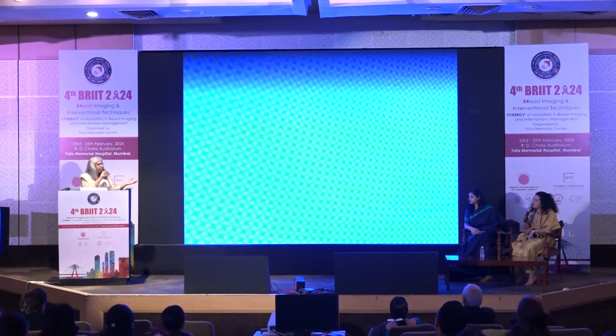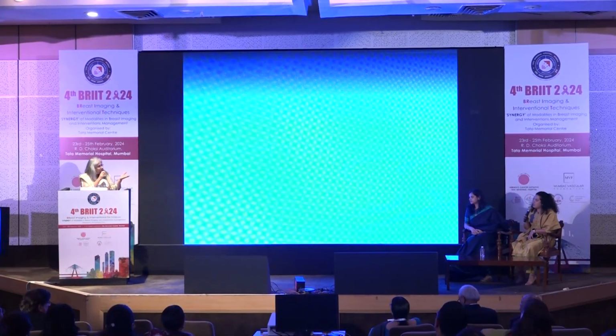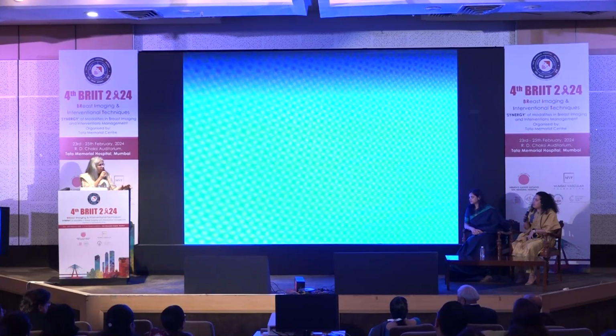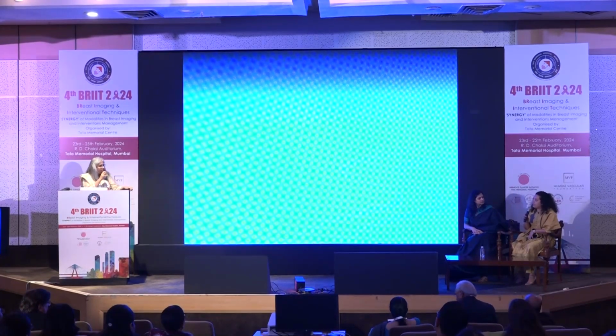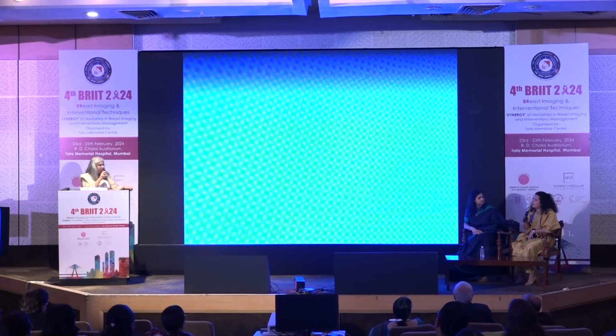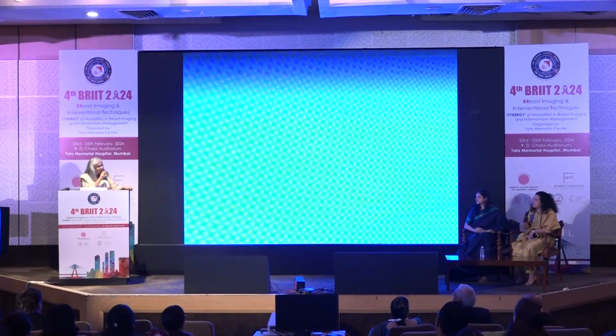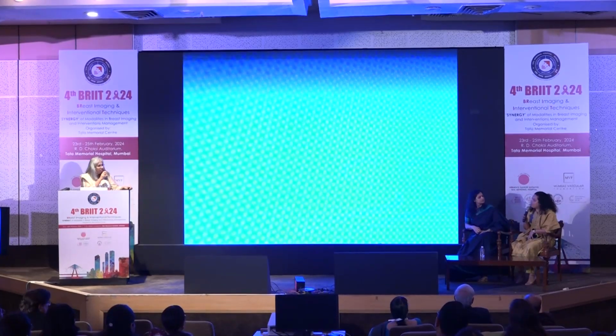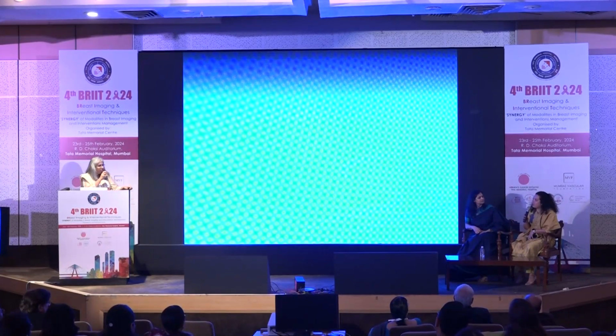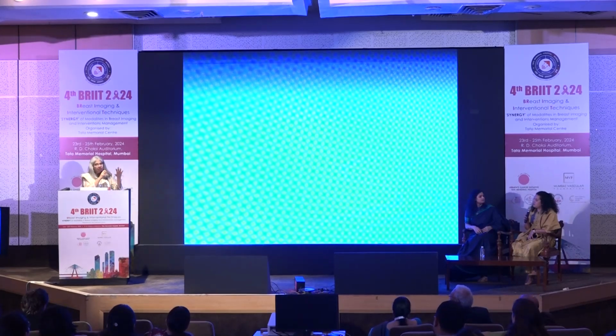And do you give the compression once the patient's released from the machine, or just while she's sitting there? And for how long? 5 minutes, 20 minutes, half an hour, 1 hour? Around 5 to 10 minutes is the usual, ma'am. But in case there is prolonged bleeding, we might increase the time as well. Okay. And do you do post-procedure mammograms? Yes. And when do you do those? Right now, we have started doing it on the same day, but earlier we were doing it on the next day.